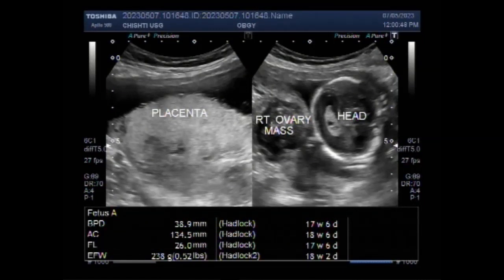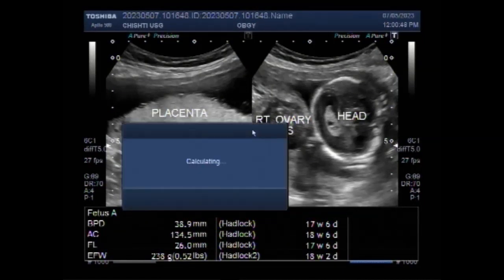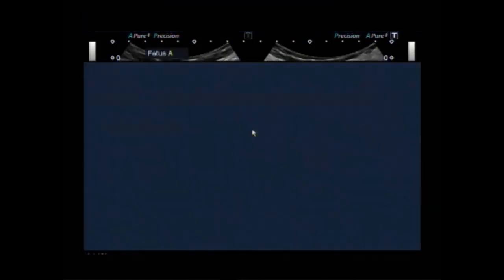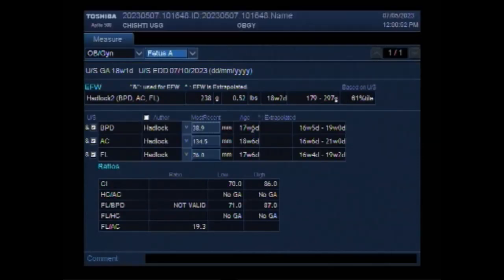Dear viewers, I hope you are all fine. This ultrasound video shows a pregnancy of about 18 weeks with a large ovarian mass.